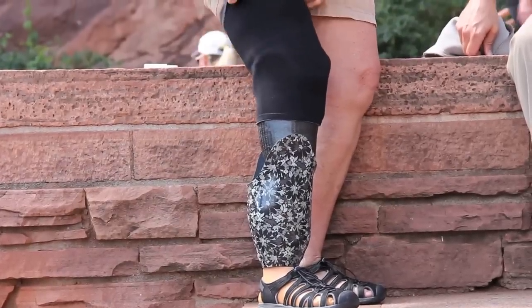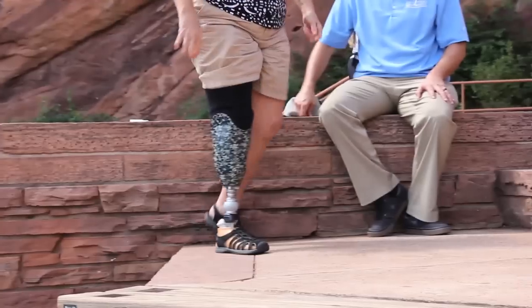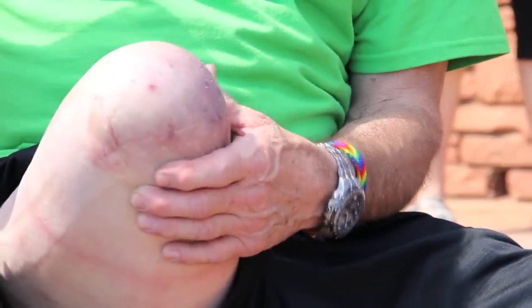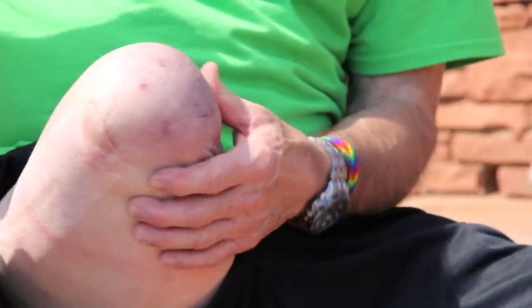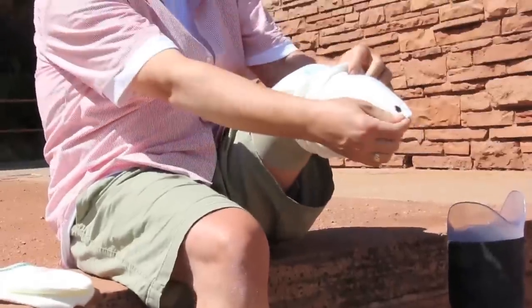Understanding prosthetic sock management is key to avoiding skin breakdown and irritation. Some things to always be mindful of: always be aware that the volume of your residual limb can change throughout the day and over time. Always be aware of your current prosthetic sock ply. Always be prepared — make sure to have extra socks available wherever you go.